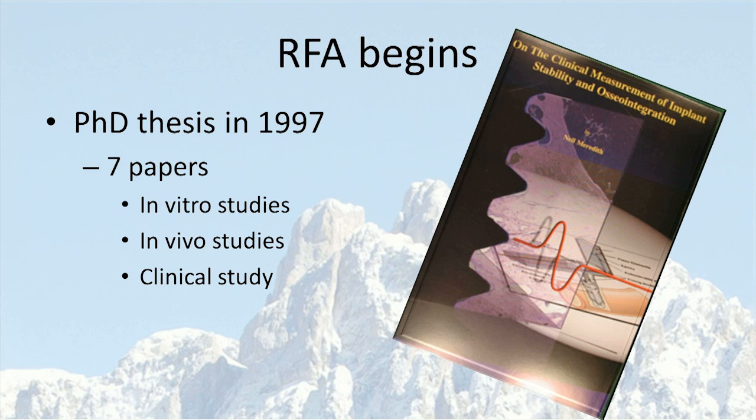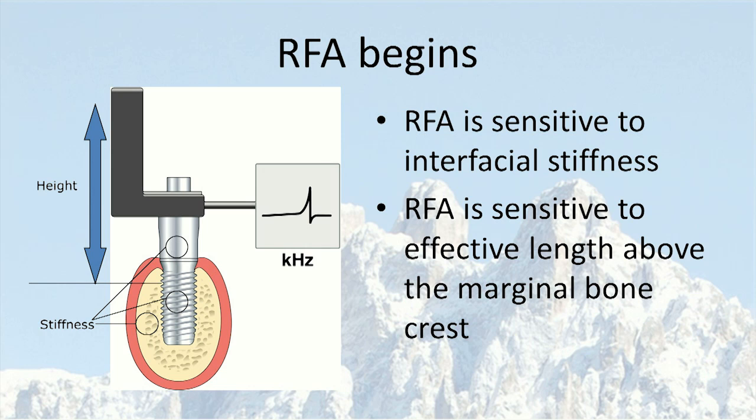The finding from this work was that resonance frequency analysis is sensitive to interfacial stiffness. So if we're looking at an implant, we have different stiffnesses, so to speak. We have the stiffness of the components themselves, and then we have the stiffness of the surrounding bone, that is, the biomechanical properties of the bone. But in these systems, the biomechanical properties of the components are constant. So it's actually changes and differences in the bone stiffness we are measuring with the technique.